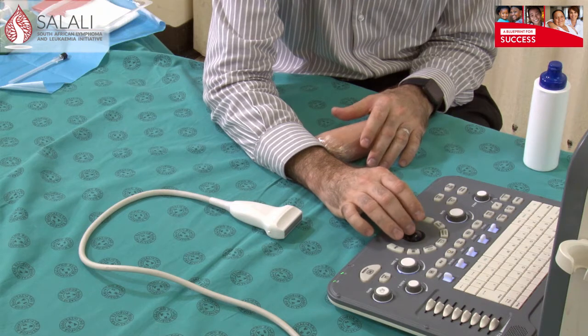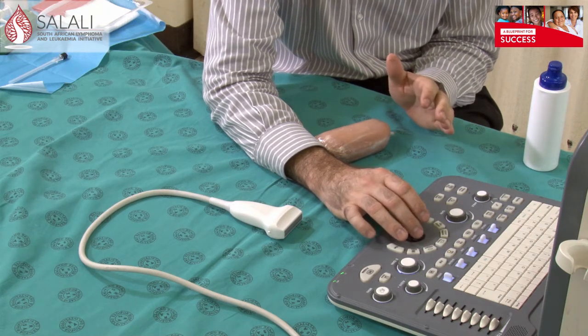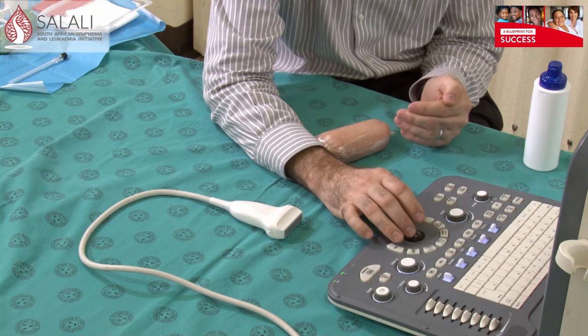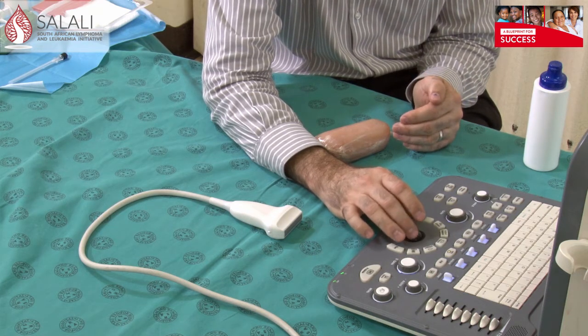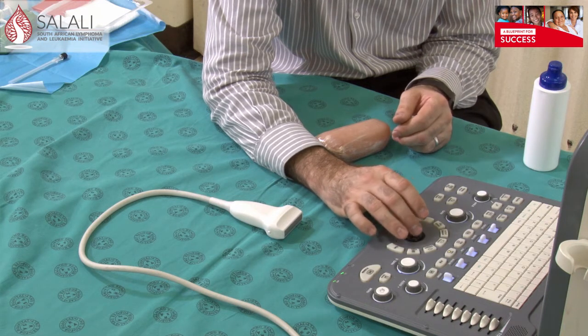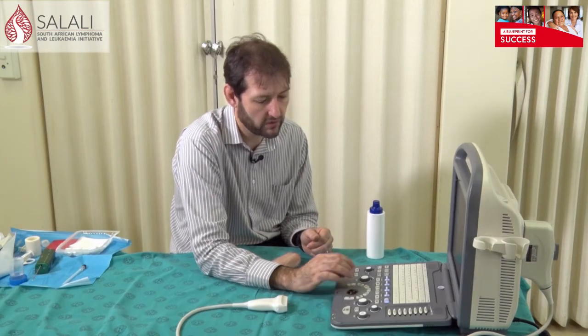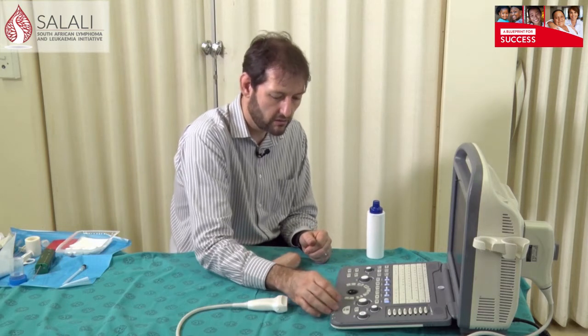When you start your ultrasound machine, the first screen you're going to see requires you to select your investigation. Machines are different — get to learn your machine. This machine gives me the options of choosing thyroid, breast, or musculoskeletal. Those are the main three settings I'm going to use when doing these biopsies. I mainly work in the breast clinic, so I'm going to put it on a breast setting.